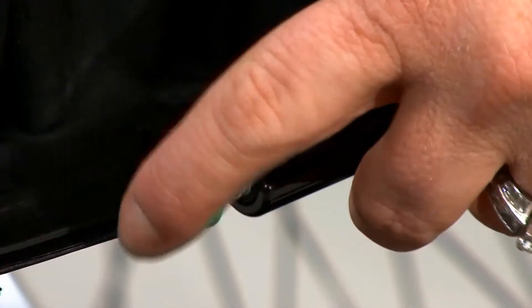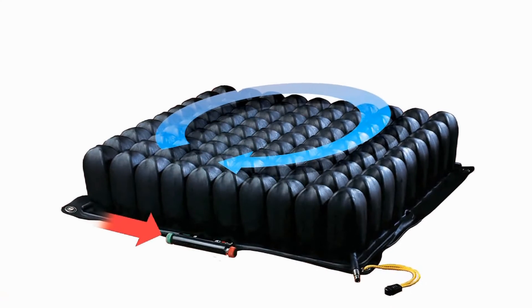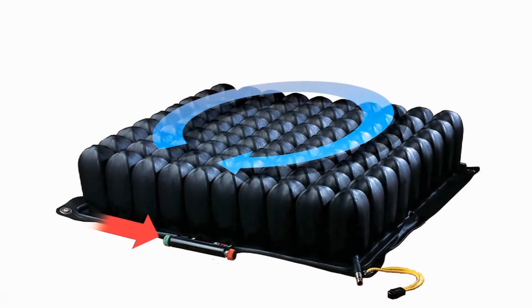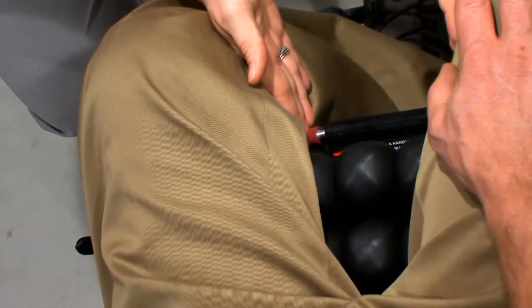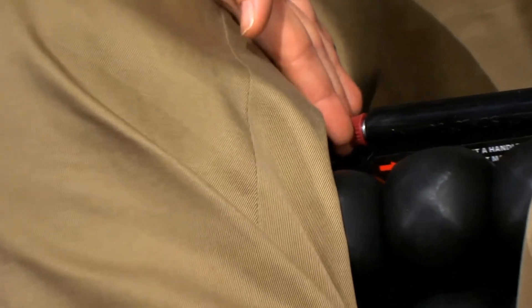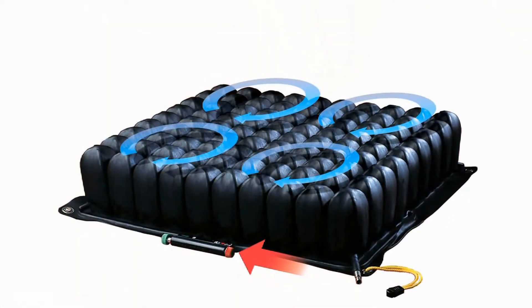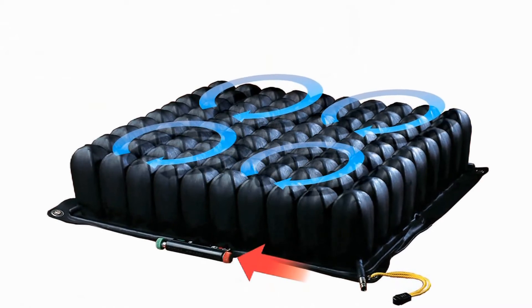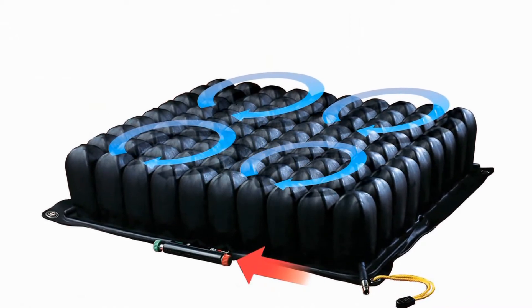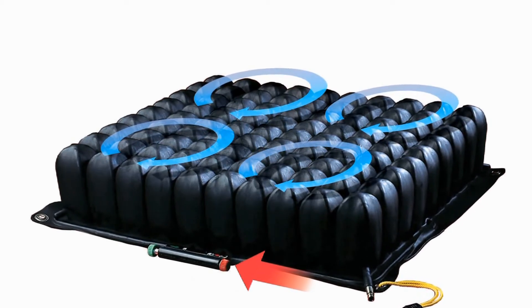When the Isoflow is unlocked — the green knob pushed in — the air is able to communicate with all the cells of the entire cushion. In essence, it is functioning like a single valve Rojo cushion. When you lock the Isoflow by pushing the red knob in, the air is then locked into the four quadrants, meaning the air in each quadrant is only able to travel within the few cells of that quadrant.